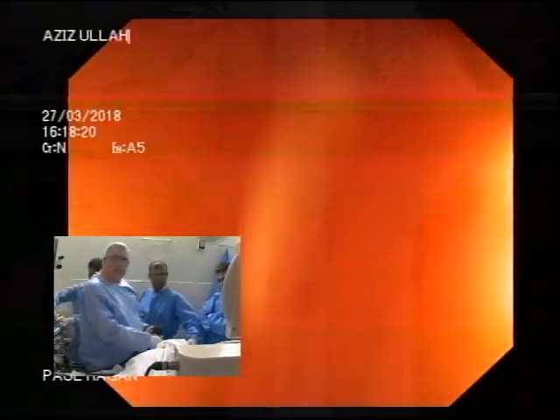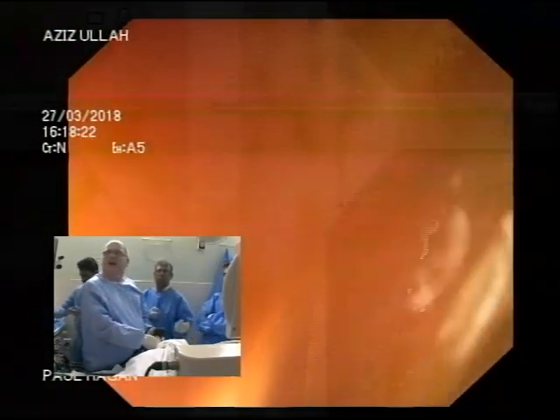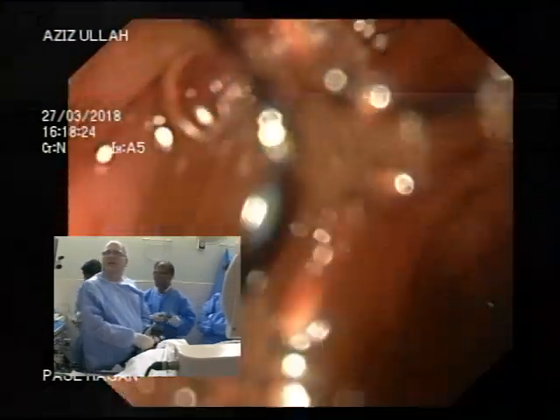The thing that I hate is looking around, because when I look around, the scope moves. And when the scope moves, then I can't see where it is, if it drops back.